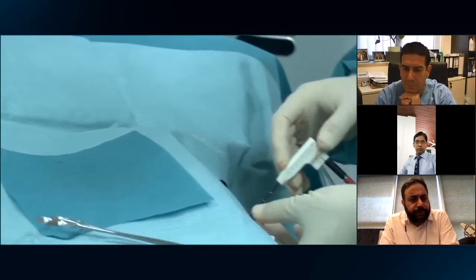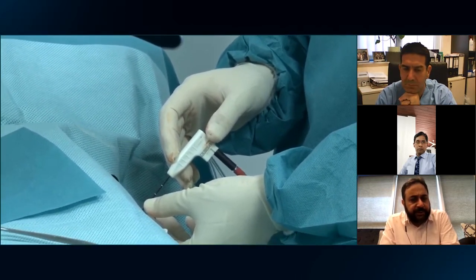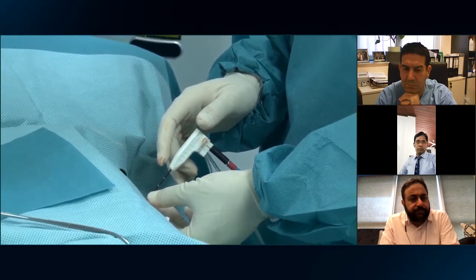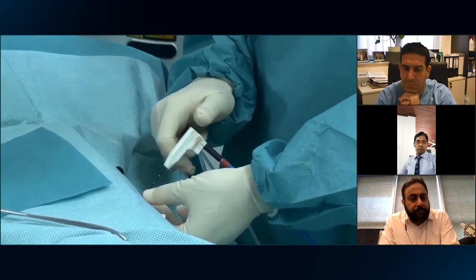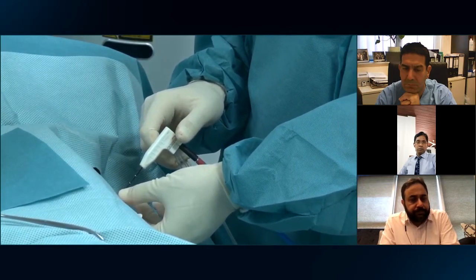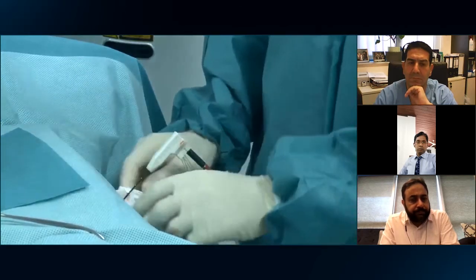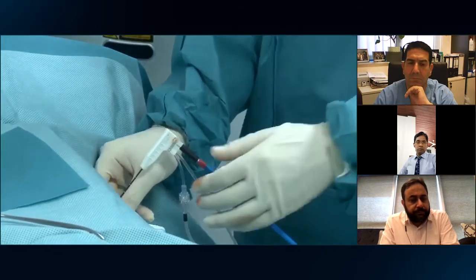Are you going to do two stage? Are you going to pull the needle slightly backwards after a few minutes, or are you going to do it all in this position? He's going to adjust the position of the antenna. So for this patient, changing the antenna position is necessary to obtain the complete ablation.